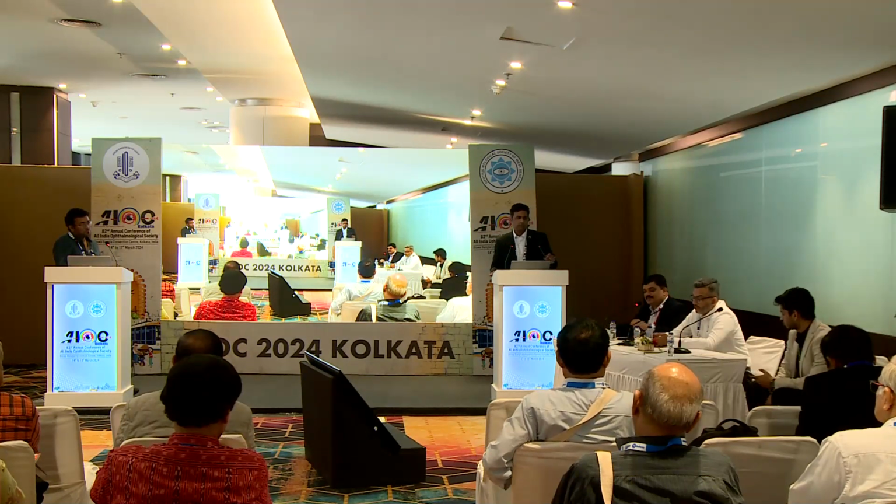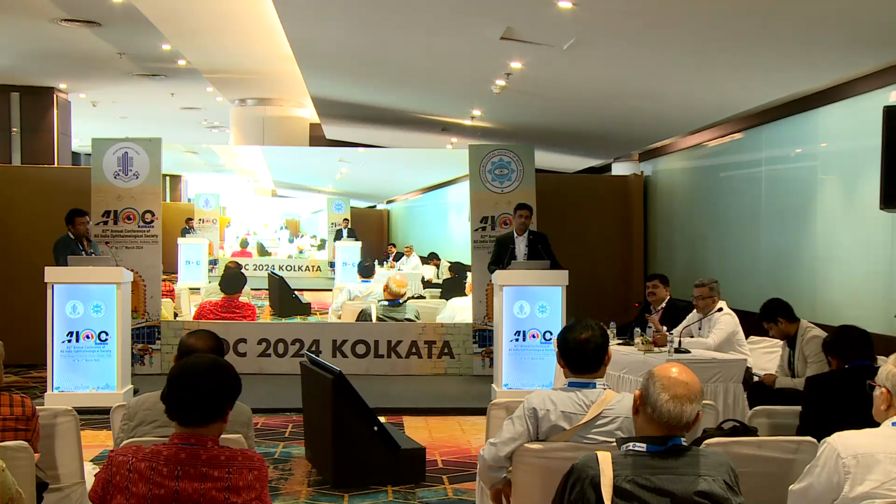And one more point, a lot of people have tried some unique lenses. My friend Dr. Sri Ganesh has tried a lens which can be glued within the bag. In some patients with a large angle alpha, when you put the lens, it does not correspond with the Purkinje image. You glue within the bag and make it centered, which, if you ask any cataract surgeon, is the most difficult job. Still he tried and he was very successful, gluing the IOL in the bag or in the sulcus. That also makes some sense, but it's all difficult.